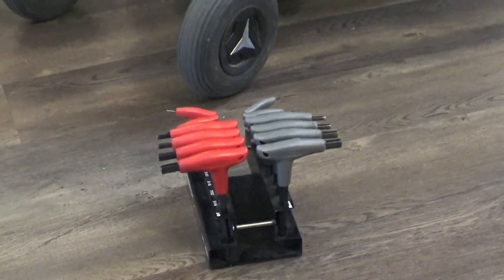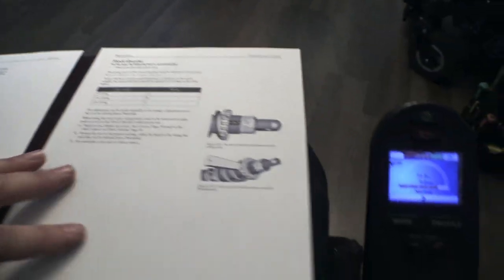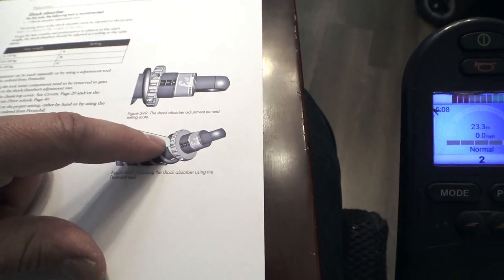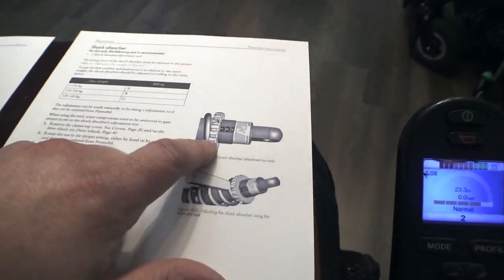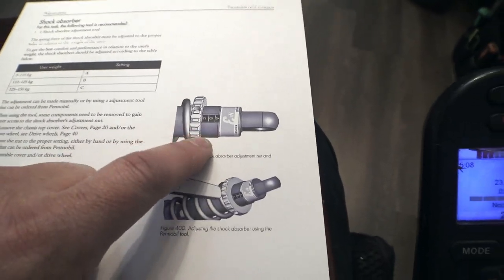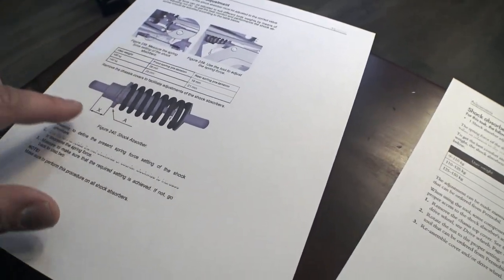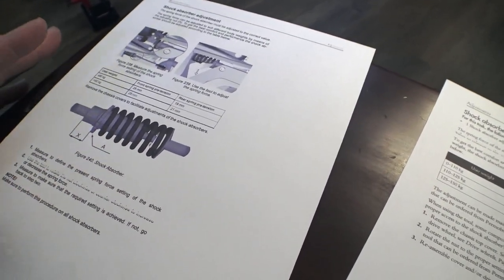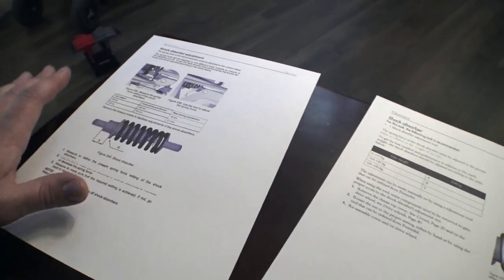It doesn't have to be right-angle T-handle ones — a normal set will work as well. Essentially all you do is get out of the chair and there are little holes all the way around these collars. You just stick your allen wrench in there and turn them. Now this is off of the M3 — these shocks show an ABC sort of setting. On the F3 they don't have that built-in sticker or marker, at least not all of them. But essentially all you do is adjust these things until you get just about the amount of tension that you want.